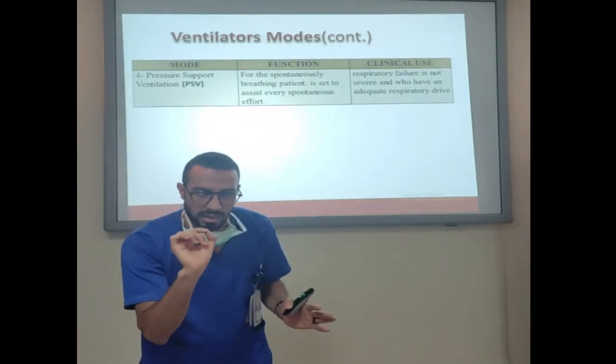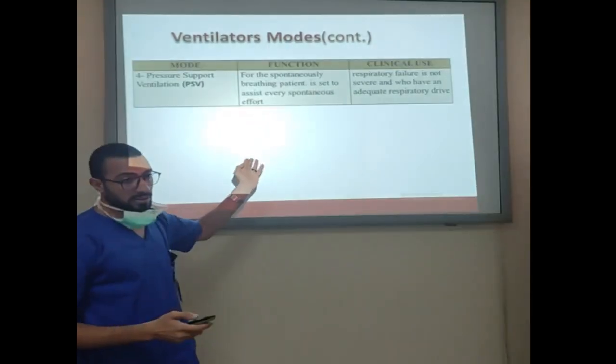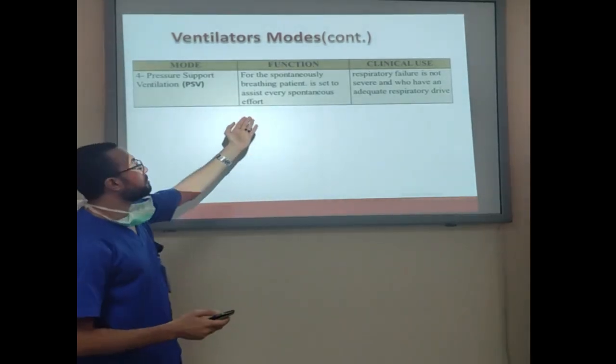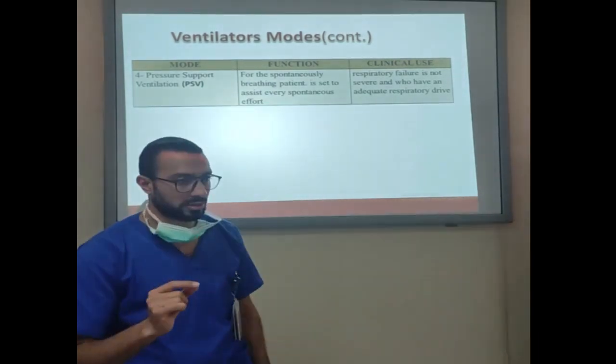So we will give him a small support, then we will remove the ventilator. So now, starting this one, we can call it a weaning mode. So PSV, the first one of the weaning modes. The PSV is the pressure support ventilation.